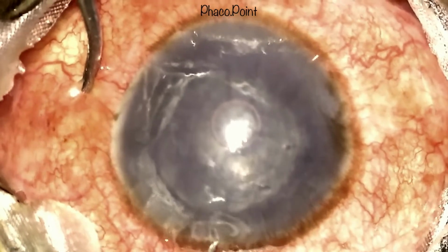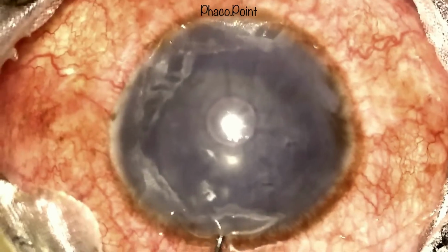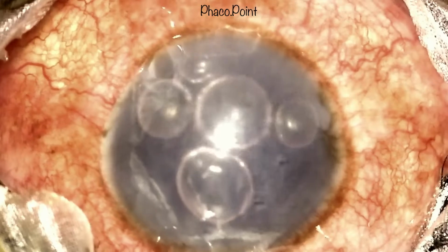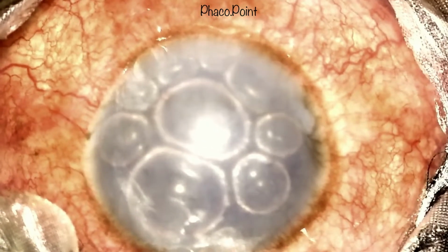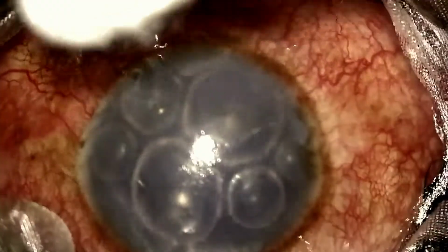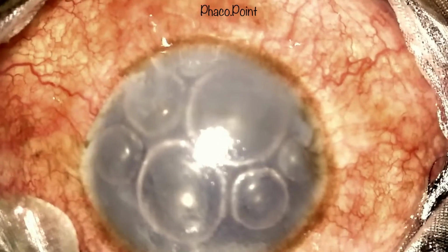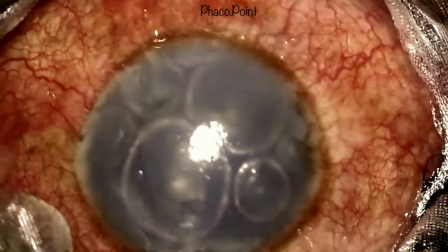This is followed by the pneumatic descemetopexy. I leave the cannula attached to the air-filled syringe within the anterior chamber. I intermittently keep injecting more and more air into the anterior chamber. Whilst maintaining the cannula in the anterior chamber, with the help of a cotton bud, I keep wiping off the fluid that keeps coming out of the venting incisions. This is what you will see in this part of the video.